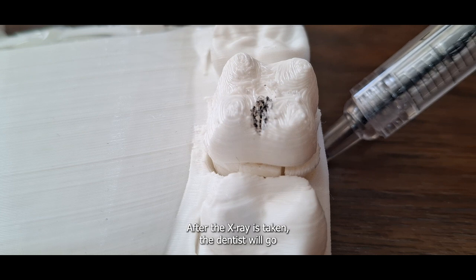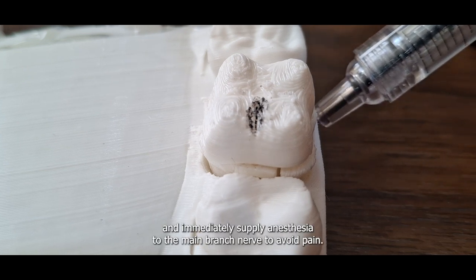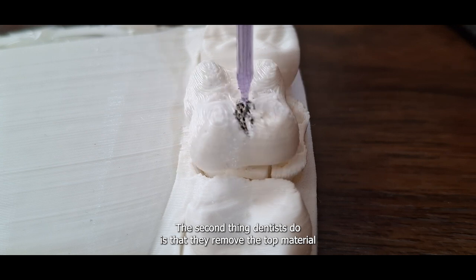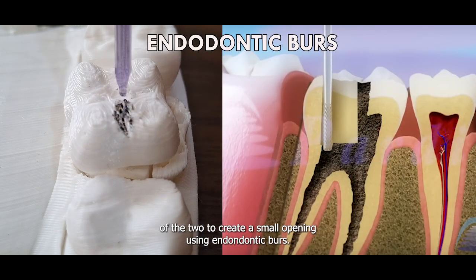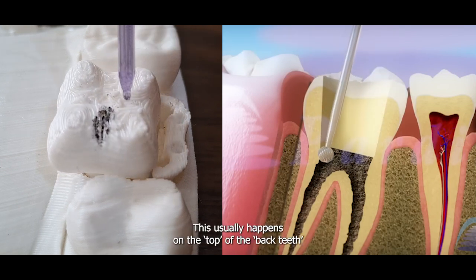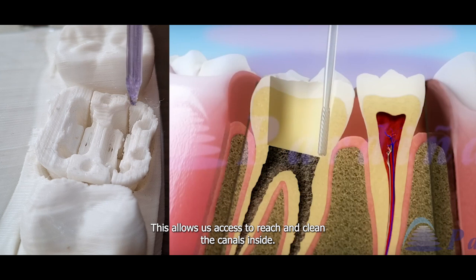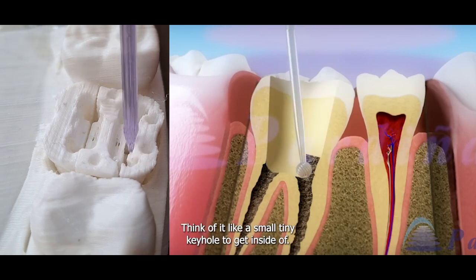After the X-ray is taken, the dentist will immediately supply anesthesia to the main branch nerve to avoid pain. The second thing dentists do is remove the top material of the tooth to create a small opening using endodontic burrs. This usually happens on the top of the back teeth and the back of the front teeth. This allows us access to reach and clean the canals inside. Think of it like a tiny keyhole to get inside.